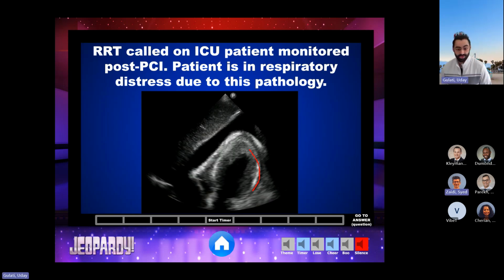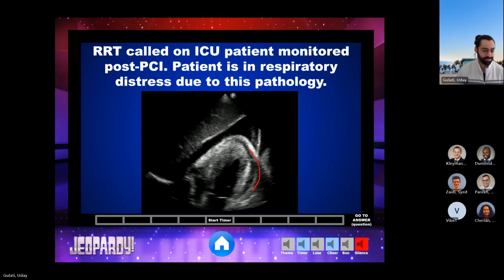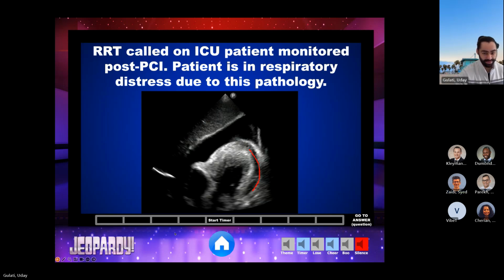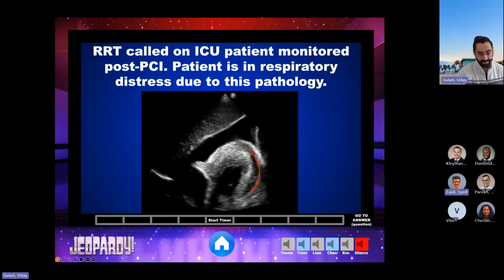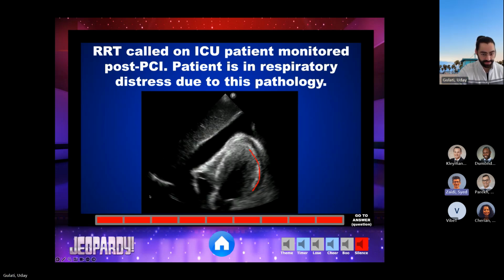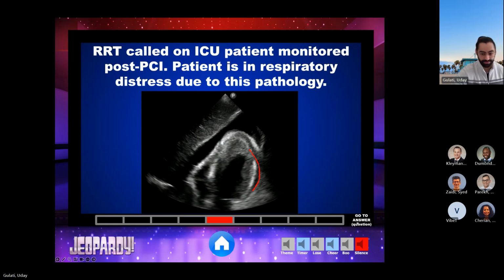So what if I said that stripe that you're seeing is the pericardial effusion? In that case, I would say that's probably like a fat pad around the heart. No, what I'm saying is that the stripe that I pointed out, that I drew, that you were concerned was a fat pad. Then that would be a pleural effusion. Right on. Right. So it's a left pleural effusion.